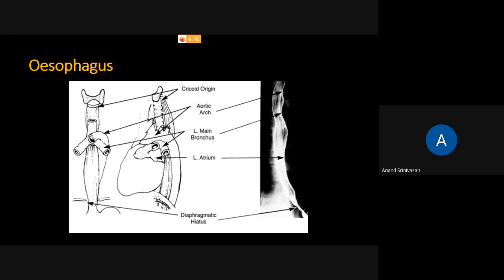In cardiovascular module last year you must have read, in mitral stenosis the mitral valve is so tight, it's stenosed, and because of that the pressure in the left atrium builds up, and left atrial enlargement is found. It is very difficult to diagnose left atrial enlargement in a normal chest X-ray, because the left atrium is located posteriorly. So one of the modalities used previously was the barium swallow.